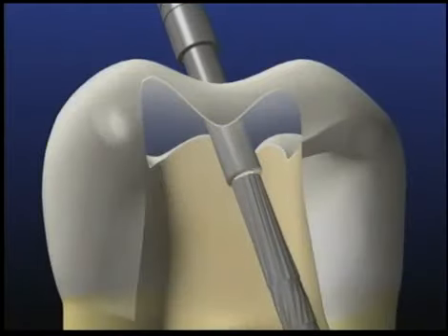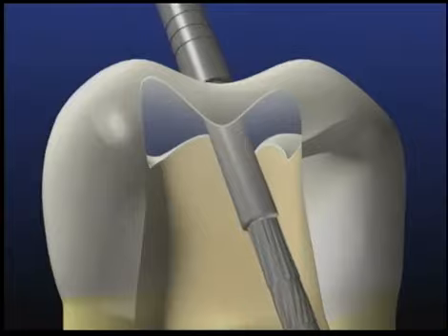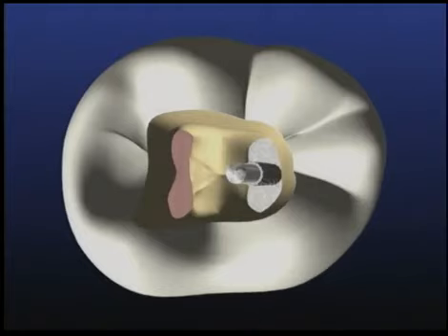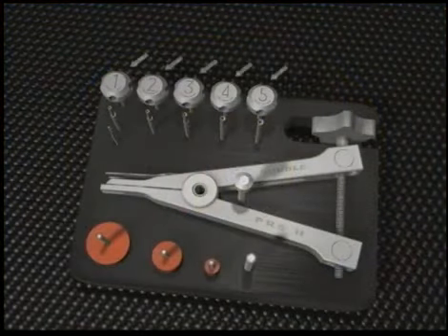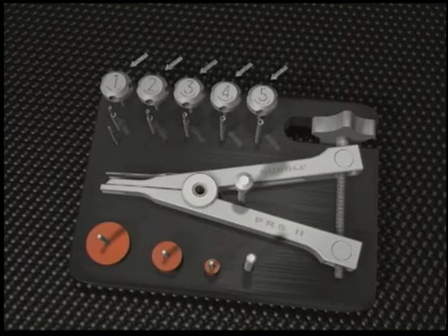Drilling with lubricant reduces heat and provides greater cutting efficiency. Attention is focused on the proper trephine post alignment during the drilling phase. The trephine progressively machines down the coronalmost aspect of the post in preparation for the next step. There are 5 tubular taps whose internal diameters range from 0.6 to 1.6 millimeters. Each tap is precisely paired to correspondingly numbered trephines.